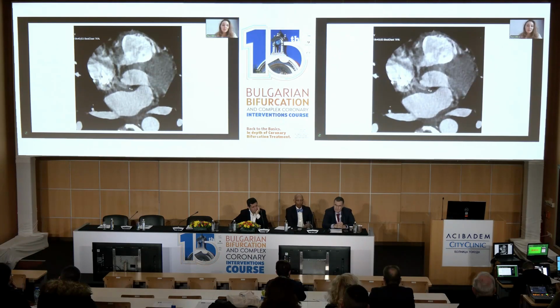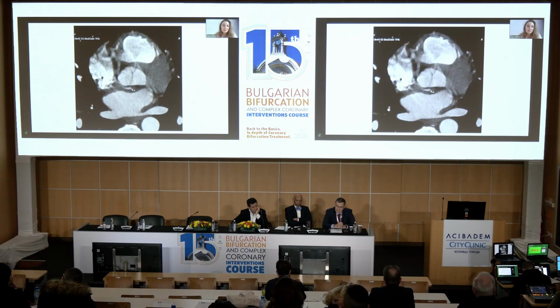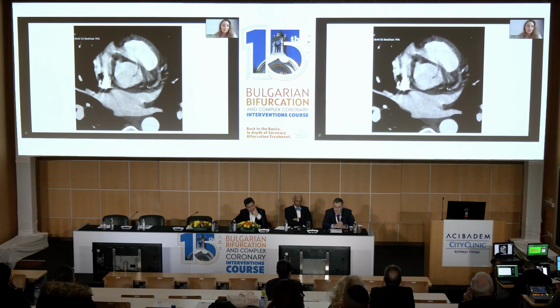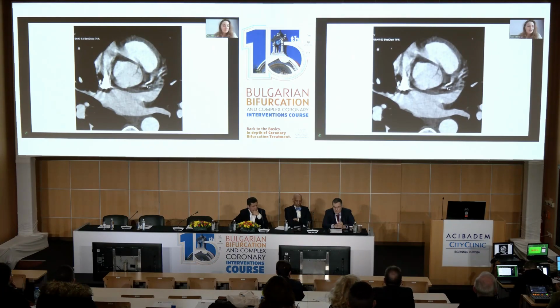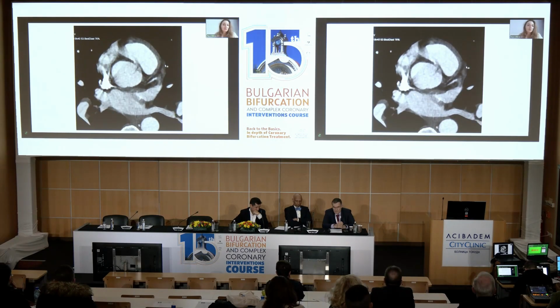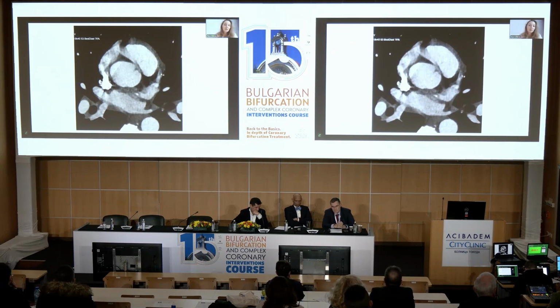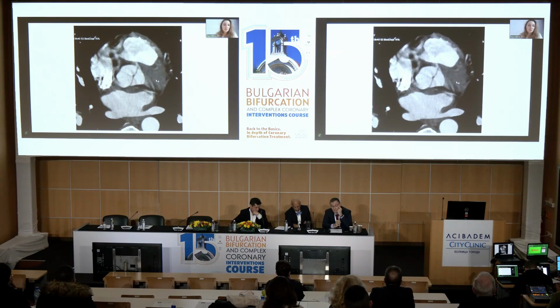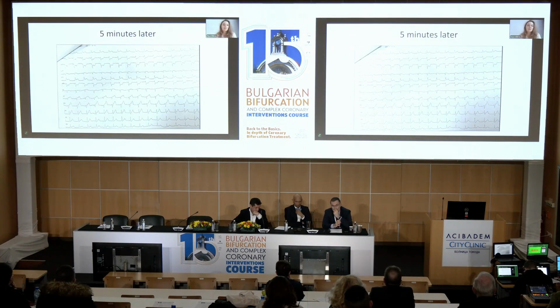And even with this low quality, we can see that here at the proximal part of the left main, there are some problems in the contrasting of this artery. So we were just trying to wonder what we should do with this patient when just 5 minutes after the CT, he had again, oh no, I have chest pain once again.